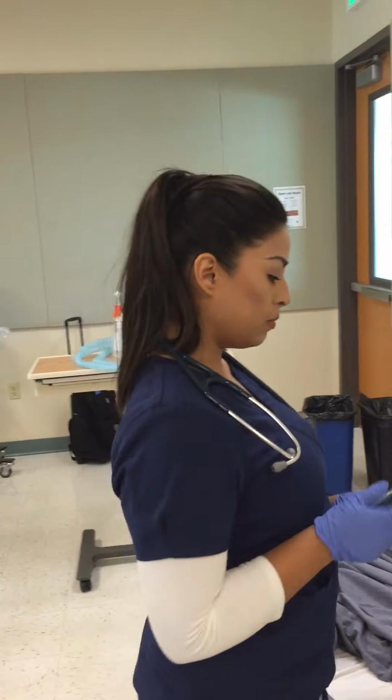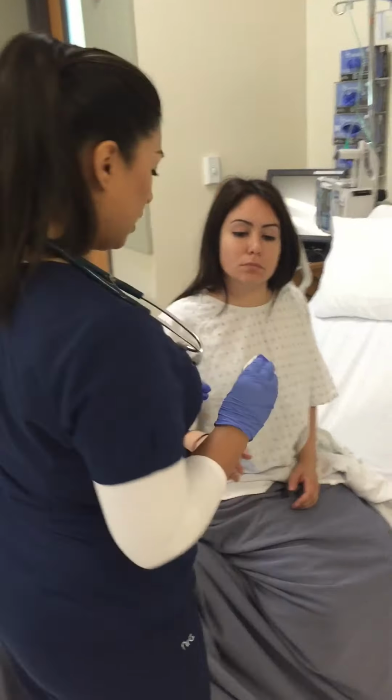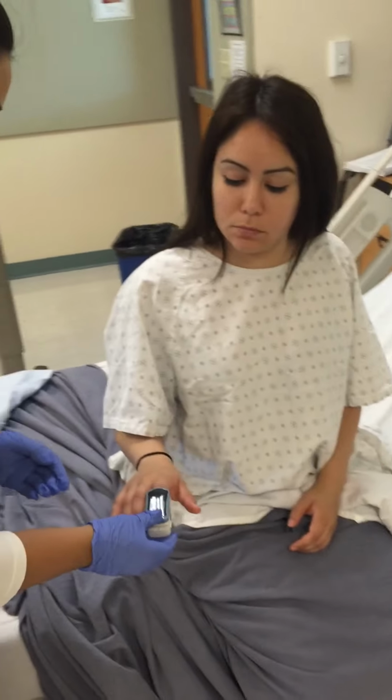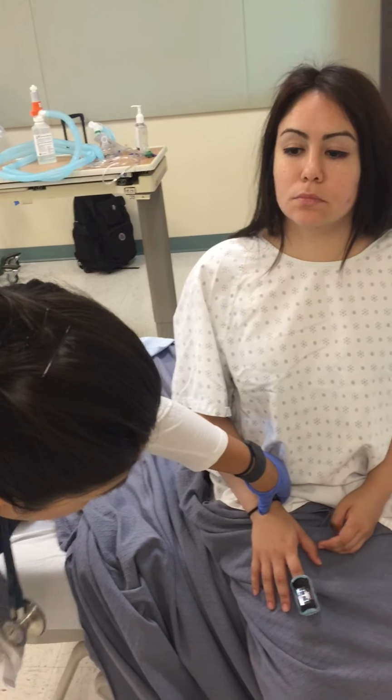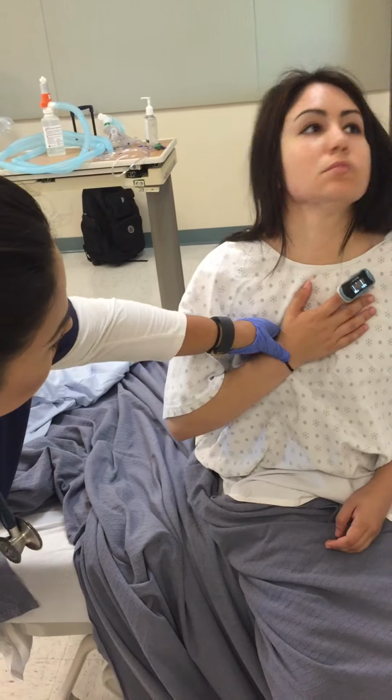Okay, so I'm going to put this on your finger, and you can go ahead and relax your hand on your lap. And make sure your pulse is in rhythm with the pulse ox. Okay.